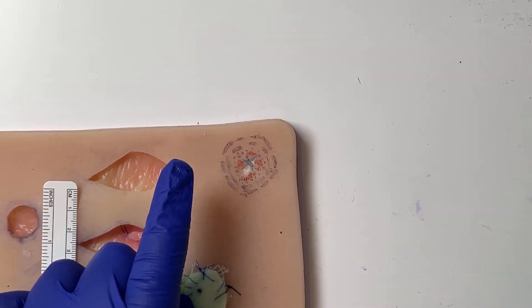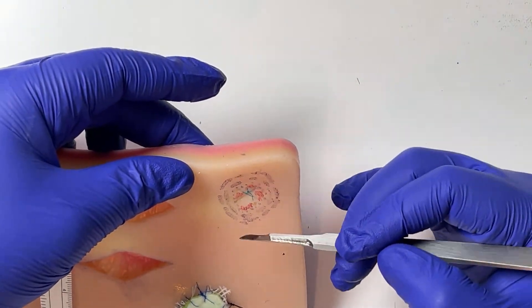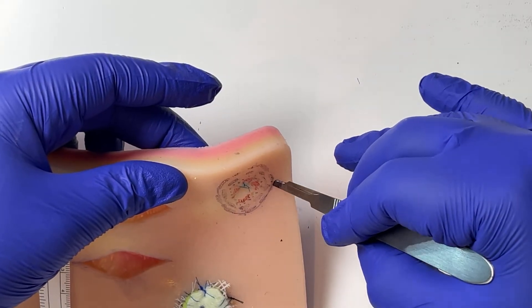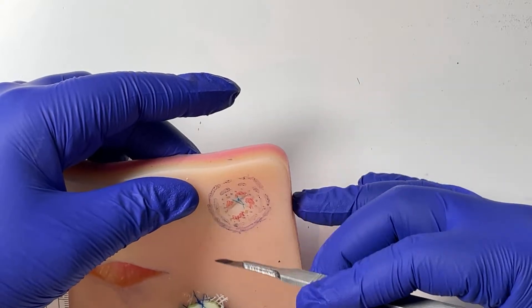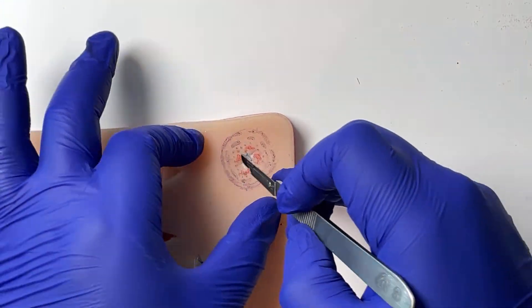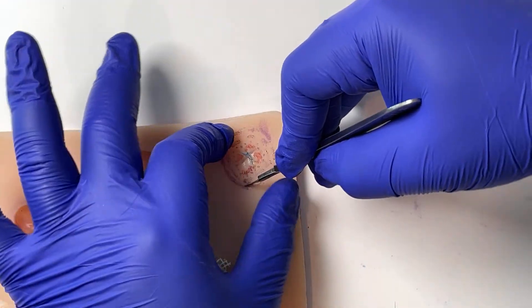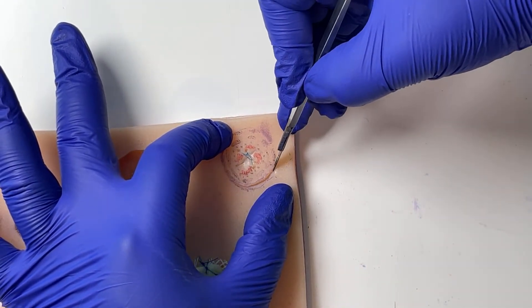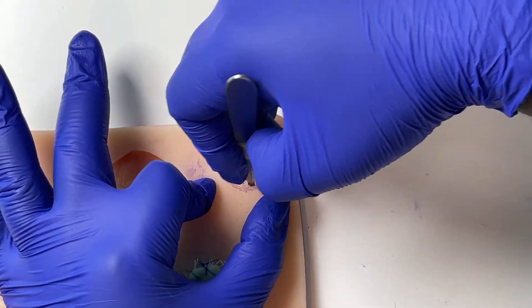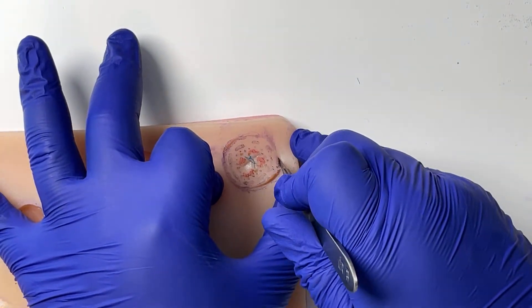One of my top tips for excision: if you're doing an excision that has different heights — top there, bottom there — start at the bottom so the blood trickles down and doesn't get in your field. Once you've made the inferior incision the blood will trickle down but you'll still see on top. If you make the top incision first, the blood trickles down into your way. Apply counter-traction, keep hands out of the way, make that inferior incision first using the belly of the blade — not the point — to achieve the depth you want. Then do the top, staying within your incision lines.